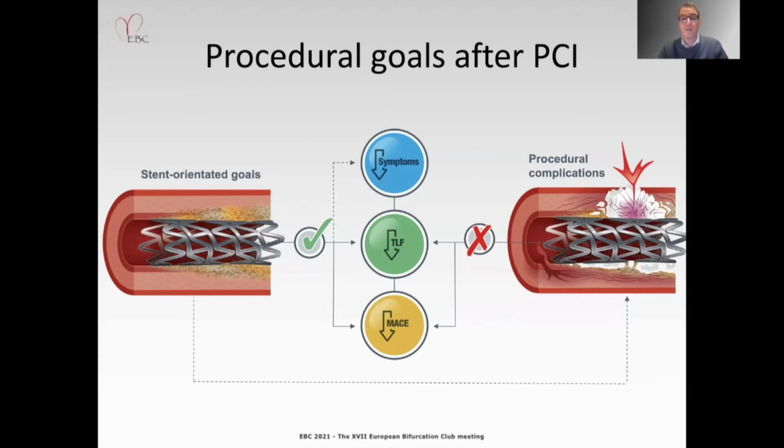Balloons have an insufficient force to crack calcium, often resulting in barotrauma or balloon rupture. Atheroablative strategies are also limited by a wire bias, potentially resulting in slow flow or even perforation.